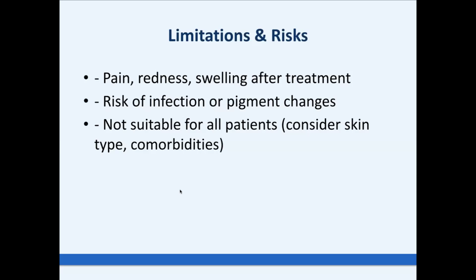Yes, not suitable for all patients. Consider skin type and if the patient has some comorbidities, or especially some virus infection, or is in some acute stage, some illnesses. And truthfully, for almost all children, we use CO₂ laser only under sedation, not only in local. But when children are older, or for adult patients, we can use an application like ointment. Anesthesia is easy, comfortable for both sides. Yeah.